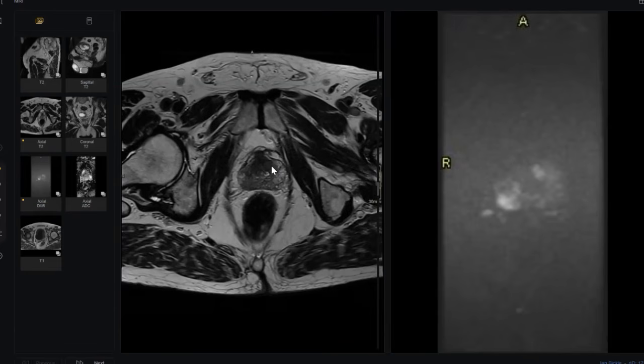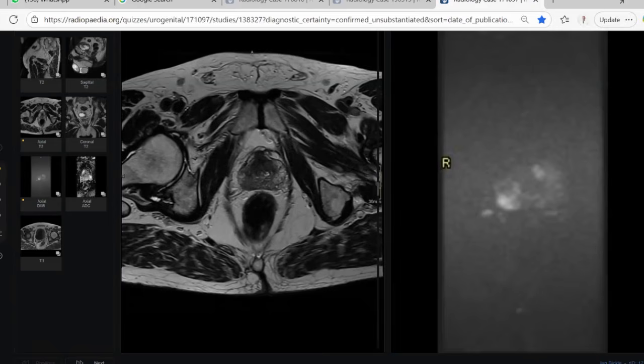There is a large table full of details. The PI-RADS of prostate, PI-RADS, is the most detailed PI-RADS one, more than the thyroid and the breast and everything. And I think it needs always to be in front of you when you are reporting any prostate case.